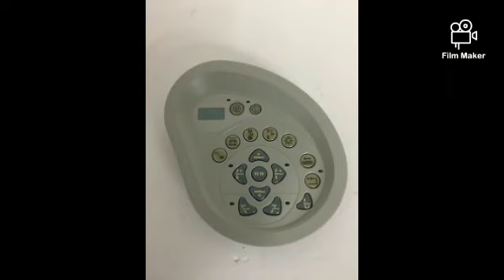And if you press the stop E, that is the E stop for scanning. So those are all the functions of our gantry keys. I hope it is now very clear to you for your operation. Moving to the topmost, you can see the first button is for pause, which means once you press it your scan will be paused. The second one is for exposure; once you press it you will get the exposure.